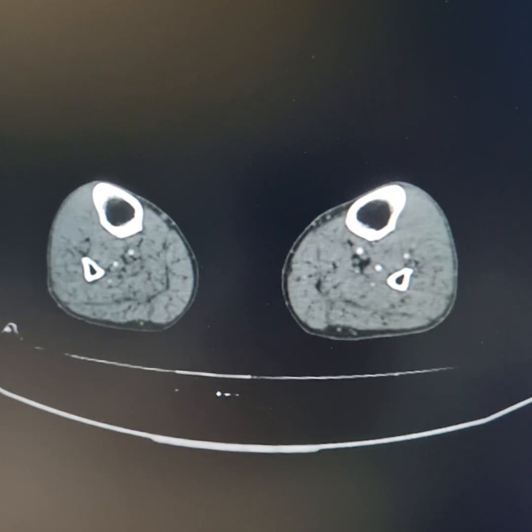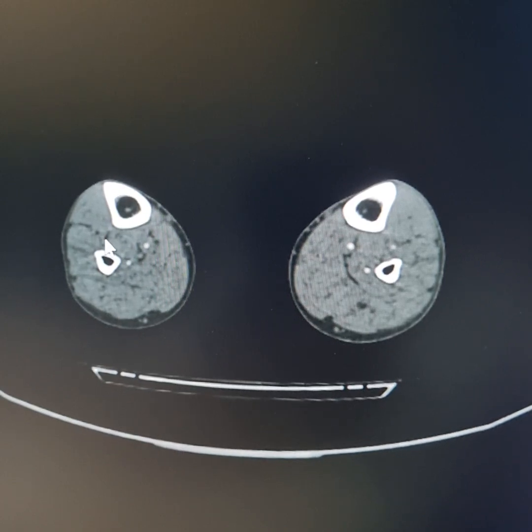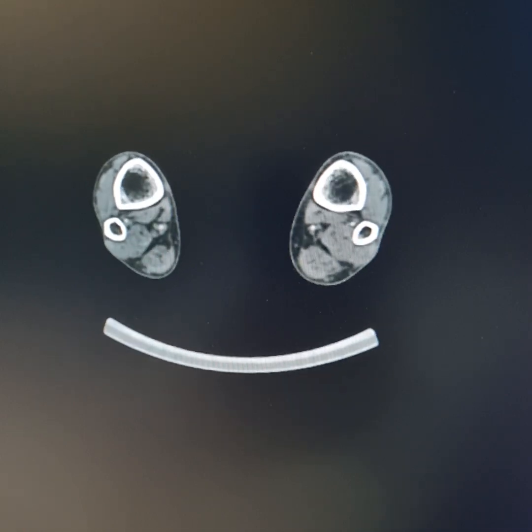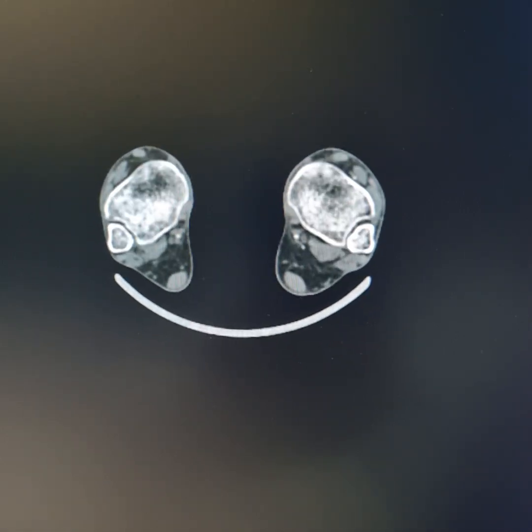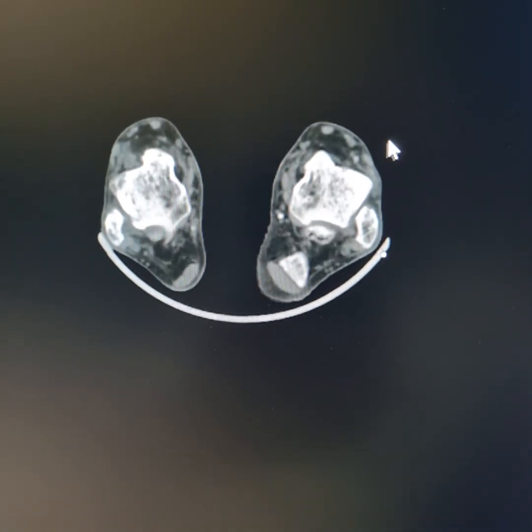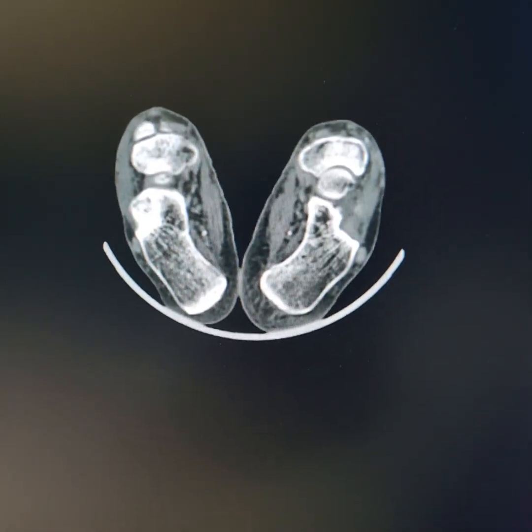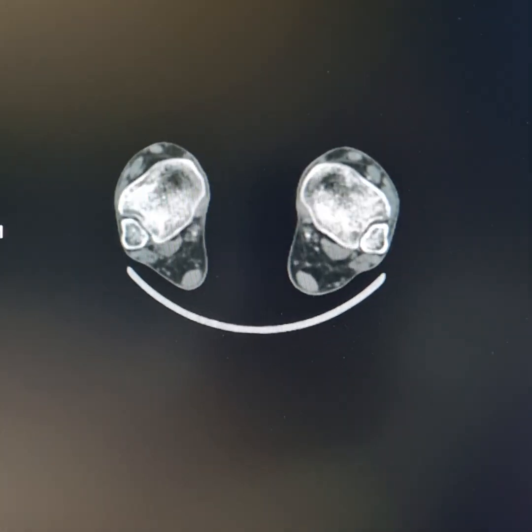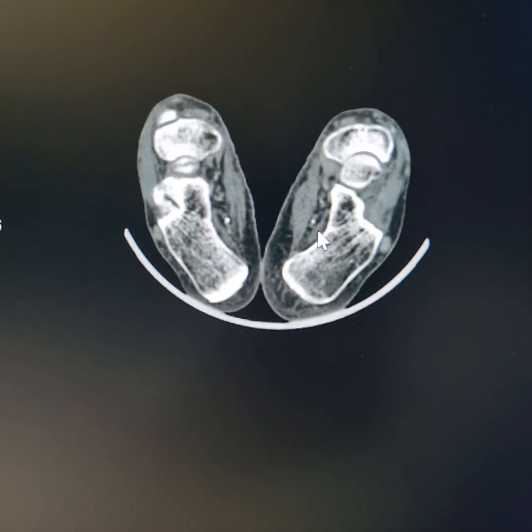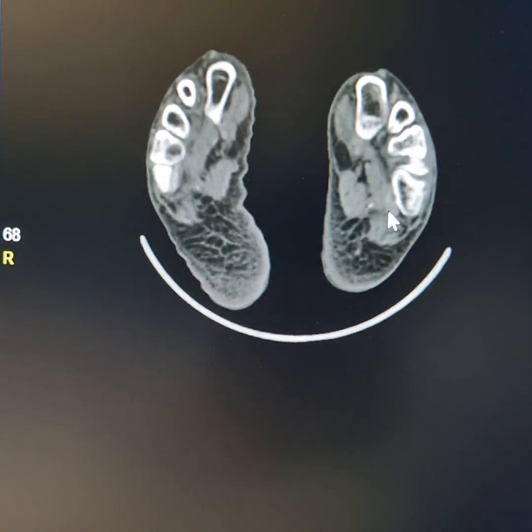Now, please compare these with the right side as well. This is the anterior tibial. On the right side, there is no anterior tibial here. The anterior tibial artery is traceable. Please follow. This is the thin anterior tibial artery. Blood flow is visible in the dorsalis pedis artery, this one here, but not in its distal branches. Same is the case with the posterior tibial artery. This is the posterior tibial artery here. This one, its lateral plantar branch is patent.